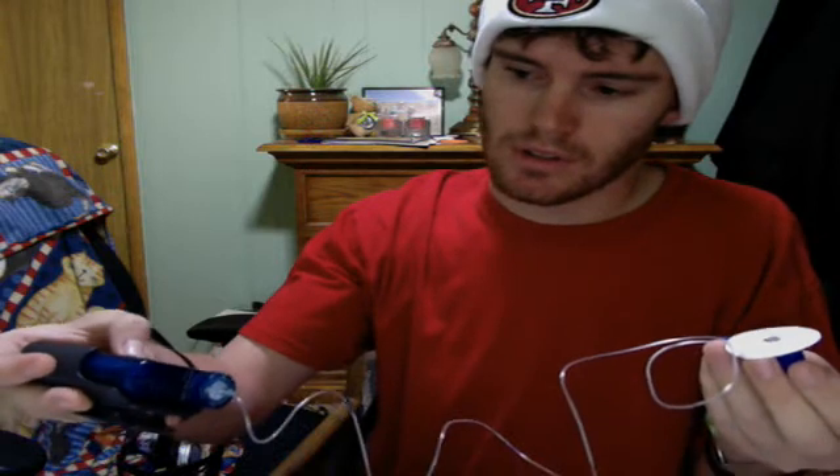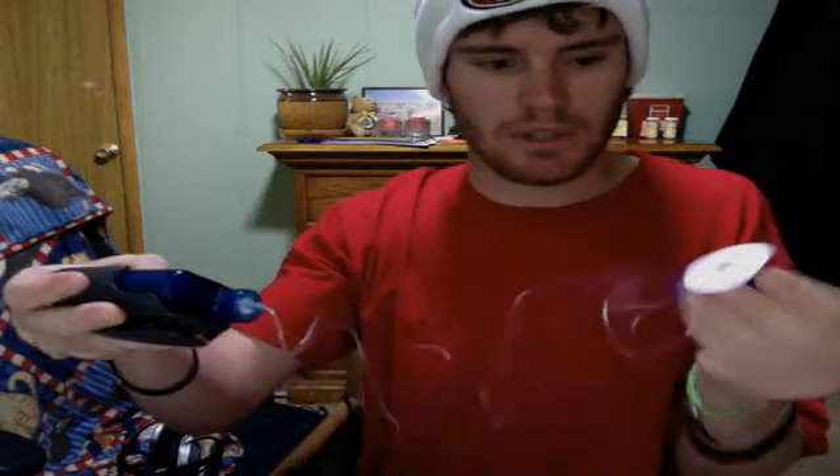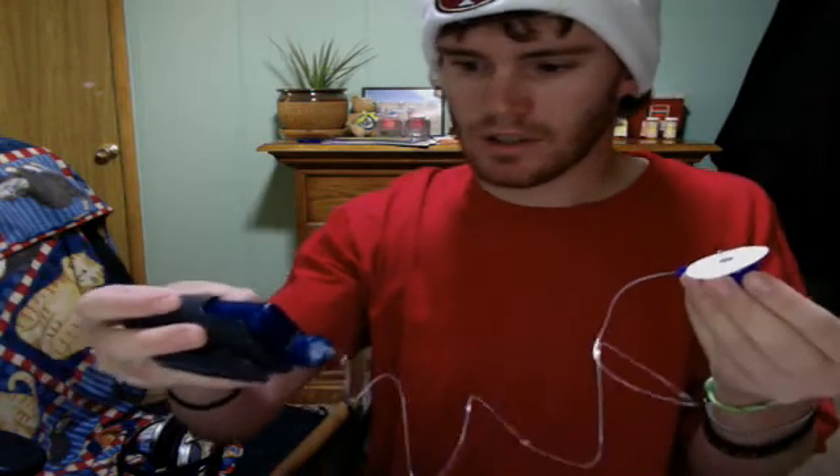Next step, you've got to prime it. What that does is it pushes some of the insulin out to make sure everything's working good. It's doing its thing — it's just telling me to hold it down. Here we go, you've got some insulin coming out.